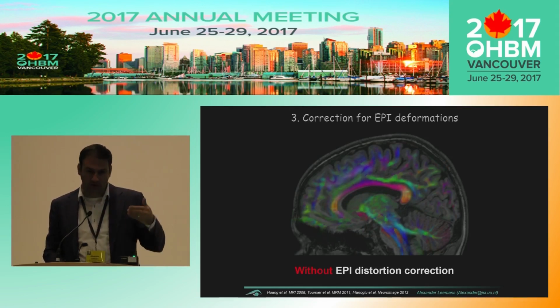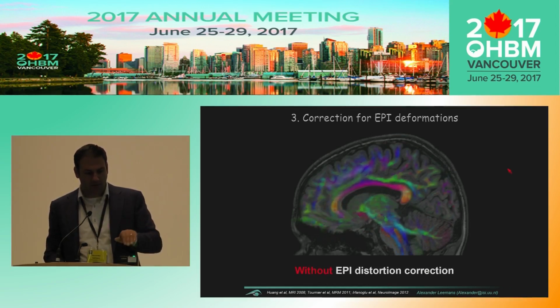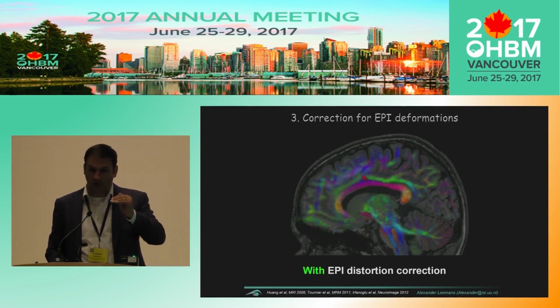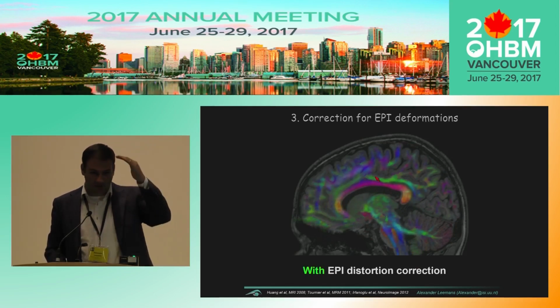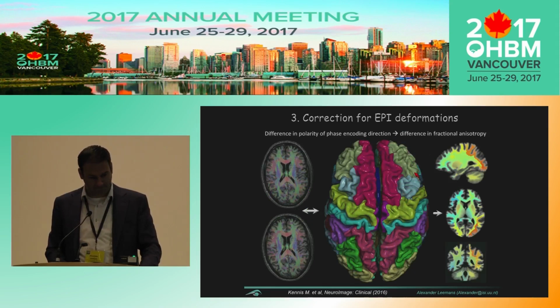So in this case, I'm showing you a sagittal view, where if I just show you before and after, you can clearly see that indeed these artifacts are just front to back. Okay, they're highly nonlinear. Focus on this area, clearly see it's going to the back, and here it's going to the front. Okay, but at least you can constrain it. So you don't need to optimize up-down orientation here, because there's no artifacts going up-down, or at least not significant.